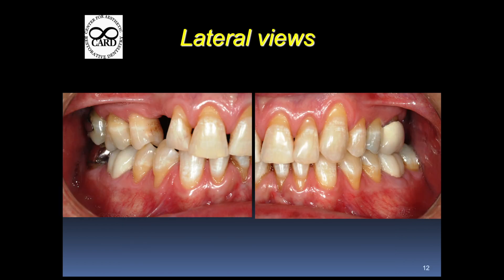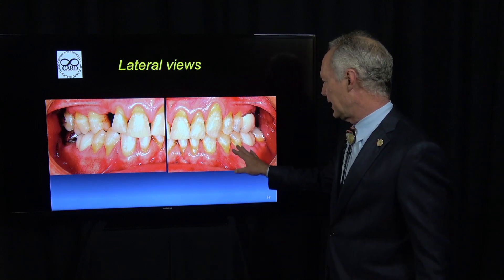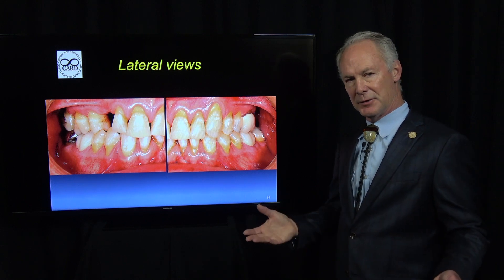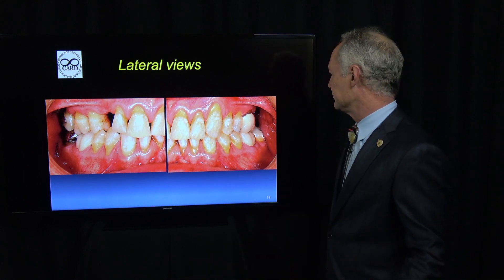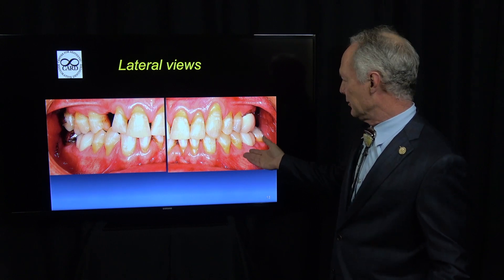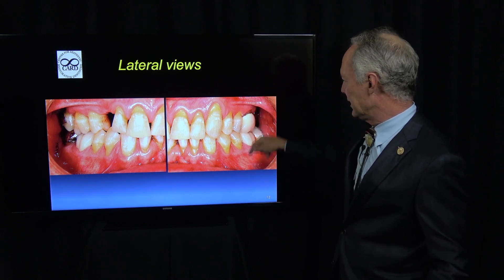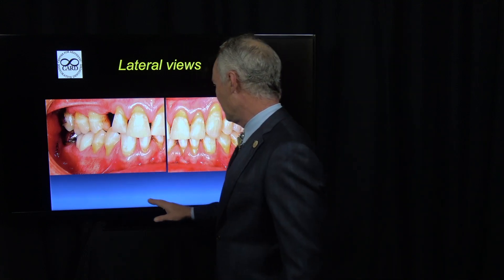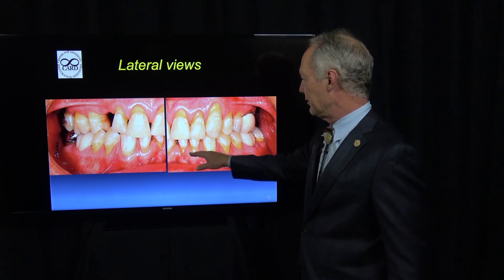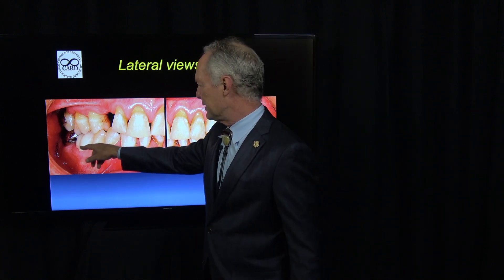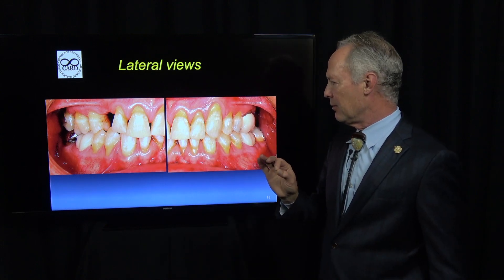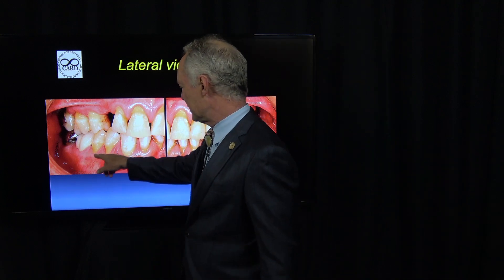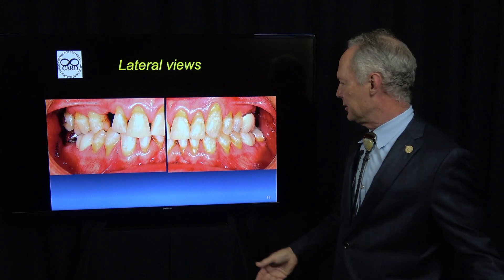For lateral views, this is just right on each side. I like to take the lateral views with the teeth together in occlusion so we can demonstrate the occlusion to the patient and have a record of it. You can see the abfraction here, the leakage under that crown, the gum recession, and leakage around that filling. What I would do differently: blow or suction the saliva off the teeth so you've got a clear view of the margins of the teeth and restorations. I also want to see the attached gingiva — whether they have attached gingiva or they don't.